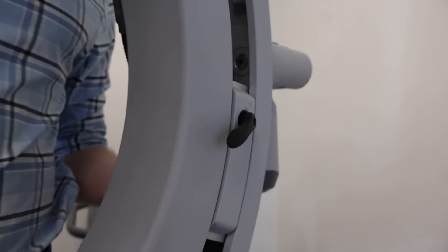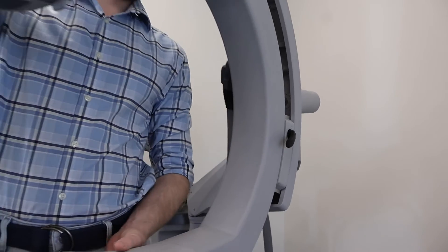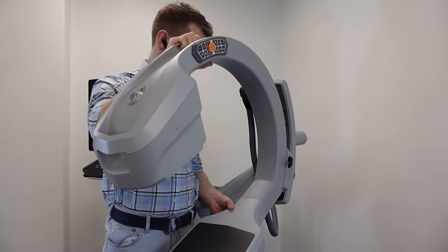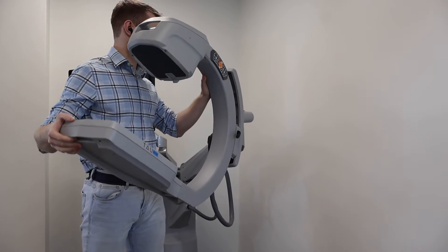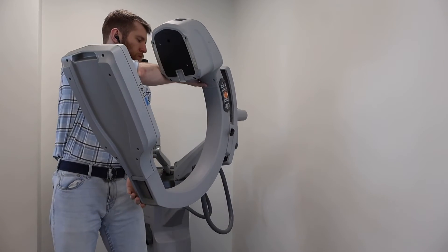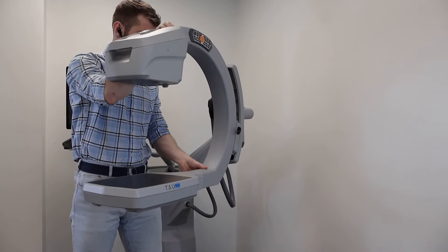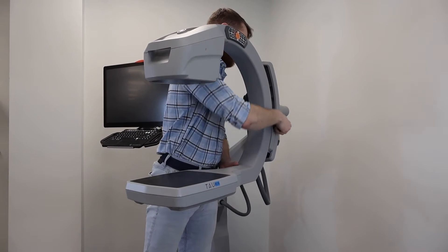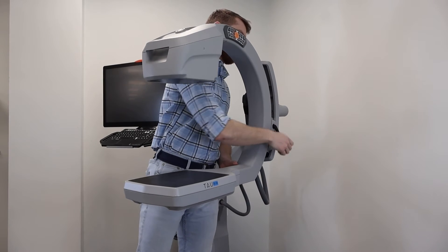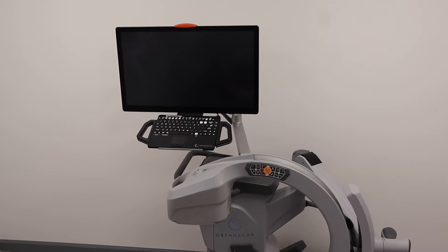The OrthoScan has an orbital rotation of 160 degrees with an arc depth of 20 inches. This C-Arm uses pulsed fluoroscopy technology and has a CMOS detector.